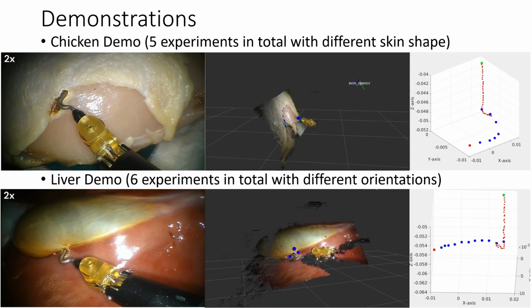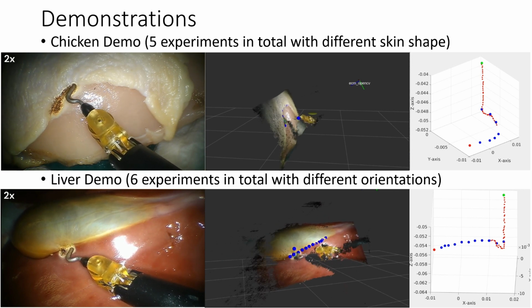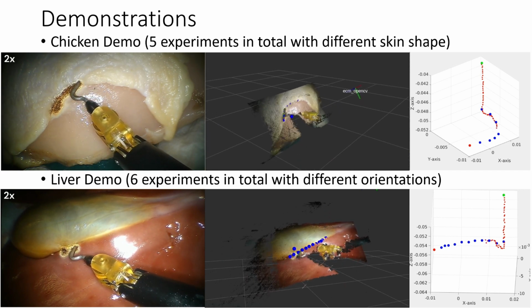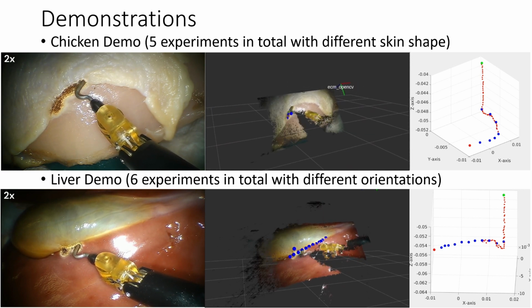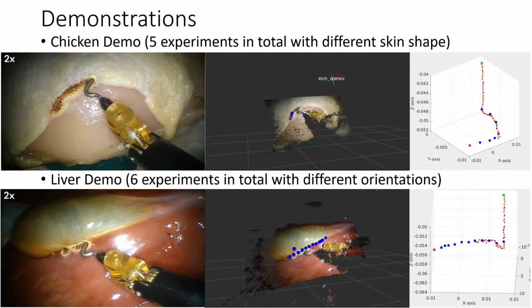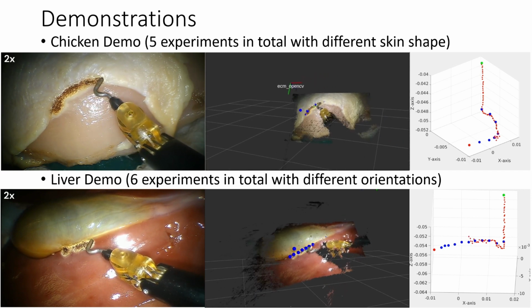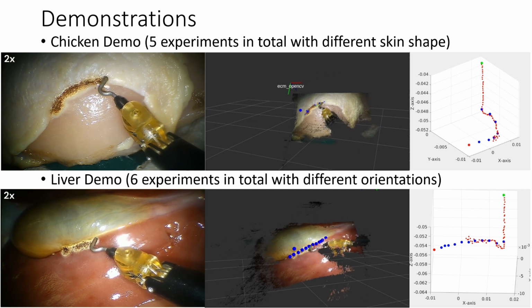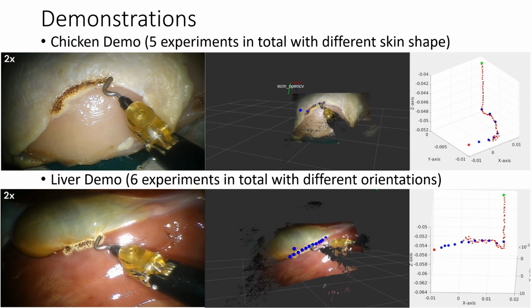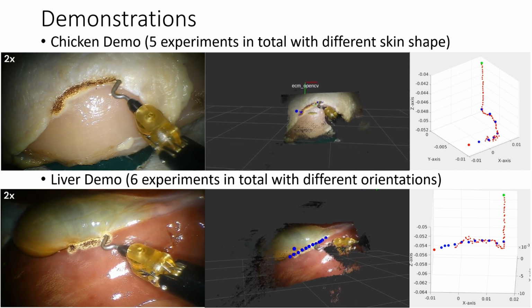For safety, we've set an initial green point as shown on the right figure. The blue points outline the trajectory based on our segmentation results, and the small red dots indicate the instrument tip's movement along these points. We conducted ex vivo evaluations on 5 chickens, each with varying skin shapes, and 6 livers with different orientations. Each procedure was completed in approximately 2 minutes, achieving sub-millimeter precision.